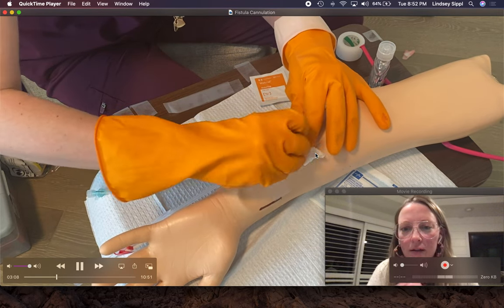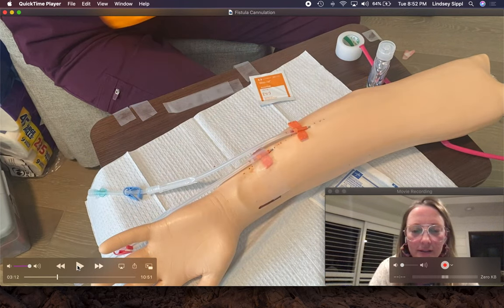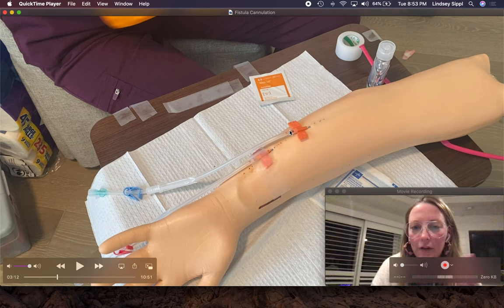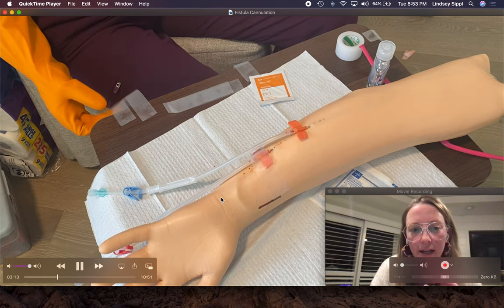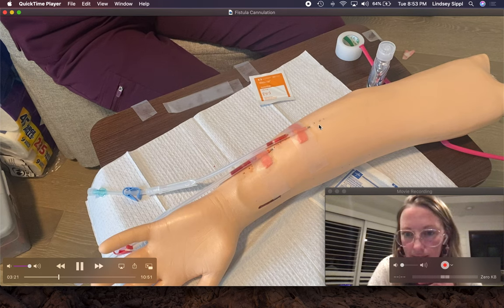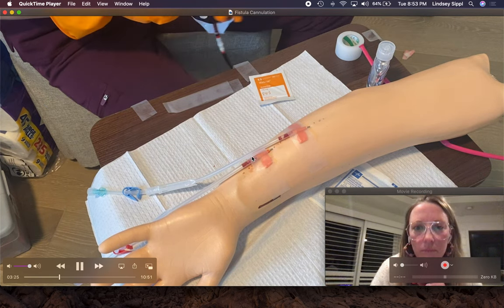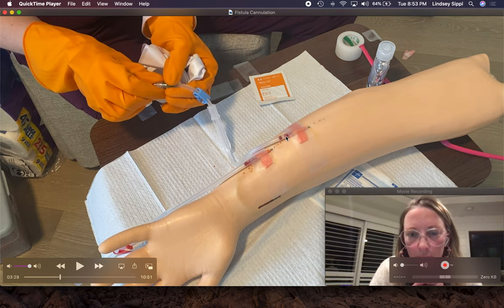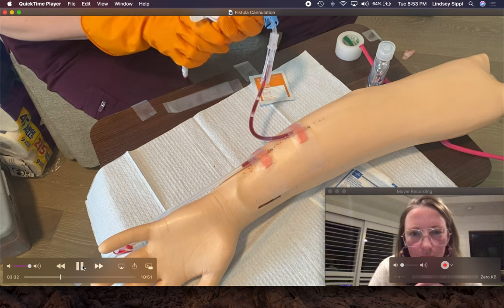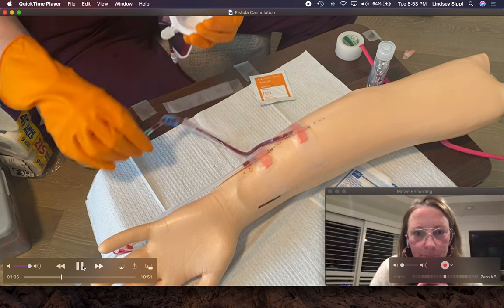I'm going to clean the area with alcohol and sterile gauze. You don't want to leave blood on the patient's arm — number one, it's gross and you want to keep that site clean; number two, you need to know if the blood there is old or new. While they're on treatment, make sure that site is clean and dry. There's a lot of blood flowing through those fistulas — at least 600 mLs per minute. The next step is to get blood all the way to the end of the needle. In a real patient there's a lot of pressure, so just by turning the cap the blood will get to the end. Then twist the cap back on and clamp it.